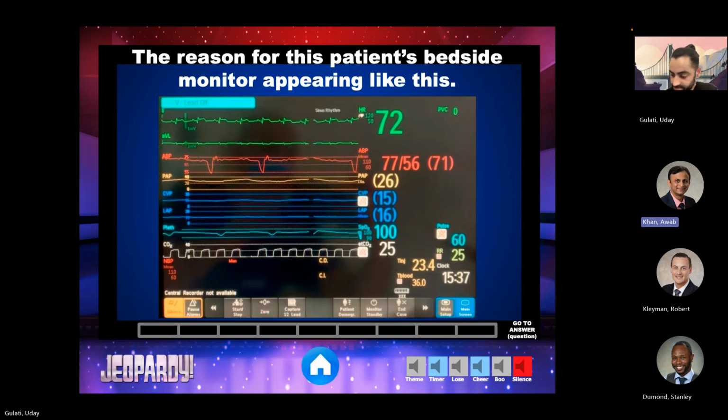Whoever did this also probably didn't rescale their A-line. Because even with people who have almost no ejection, you still see some sort of beat-to-beat variation on your A-line. Right, that was misleading. So LVAD. I confirmed in the paper where I got this image from. I said it's an LVAD with a maladjusted A-line scale.